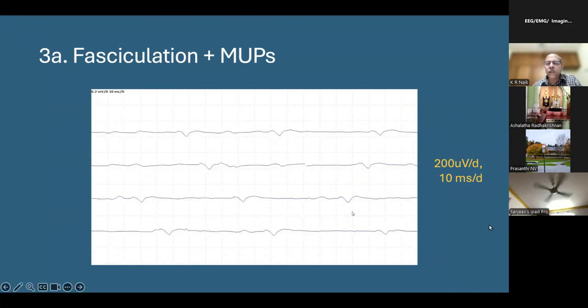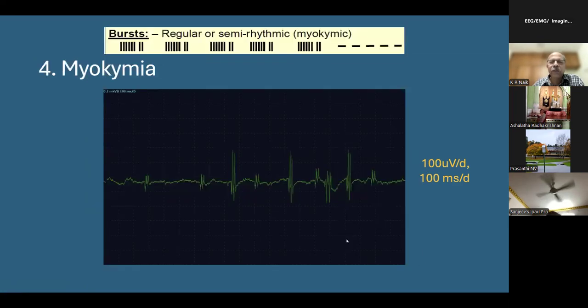You can't expect the patient to completely relax always. It's difficult for many people to relax the muscle during the muscle contraction. So it's like listening to a musical instrument during a symphony. You can differentiate between different types of drums or different types of string instruments. You'll be able to identify them. Similarly, you should train your ears to identify.